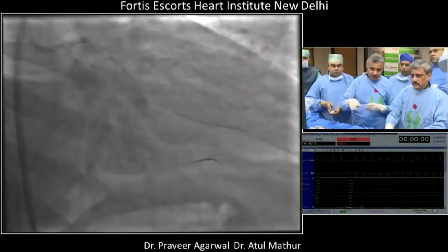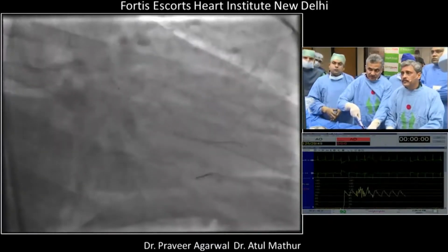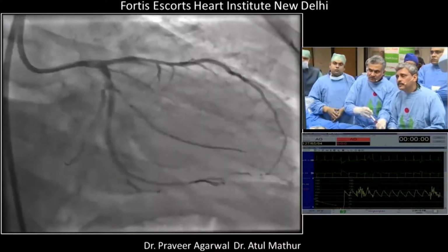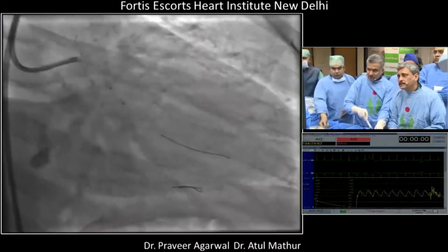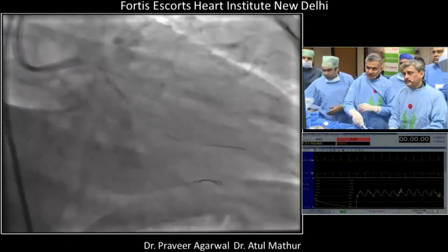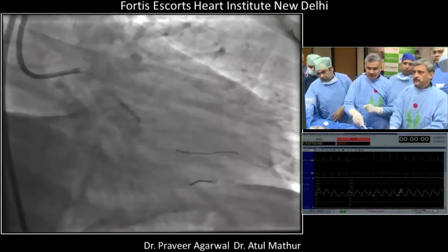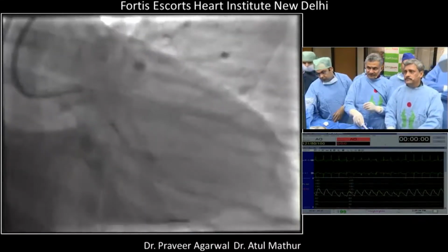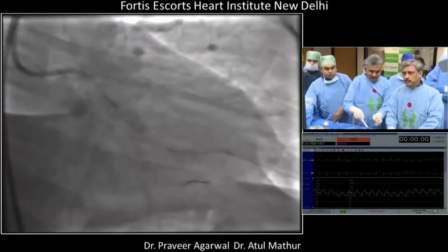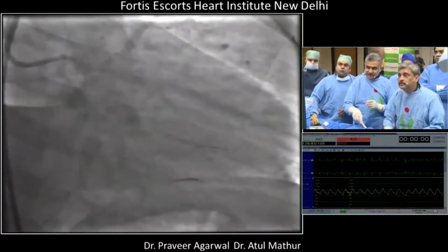So this goes. This will cut there, further down. That's good. Okay, go up. 1, 2, 2.5, 3, 3.5, 4, 4.5, 5, 5.5, 6, 6.5, 7, 7.5, 8, 8.5, 9, 9.5, 10. Good enough. Deflate. Now we just cut both. I'll just put it back, you know.